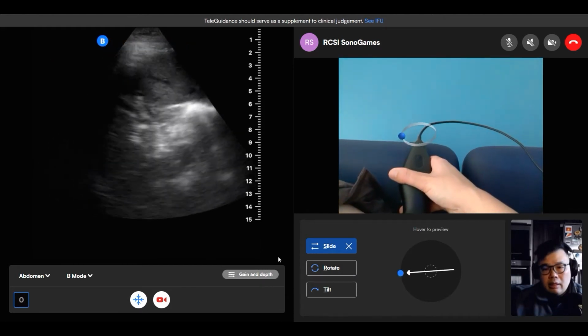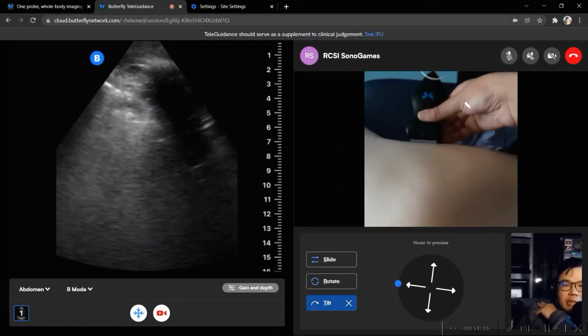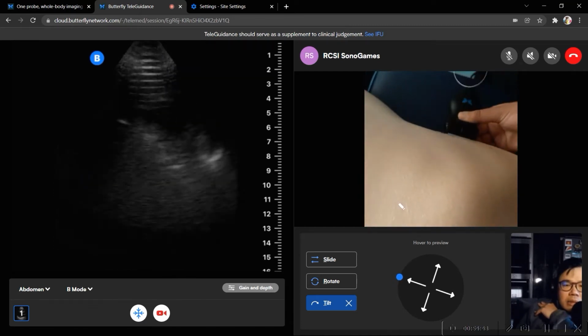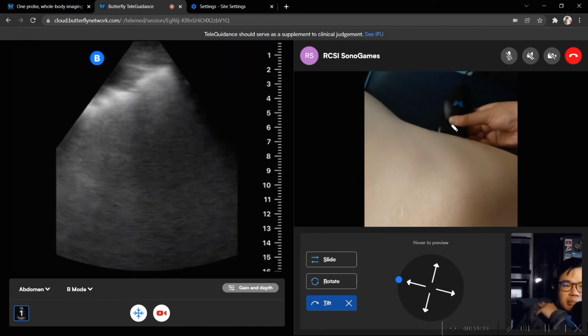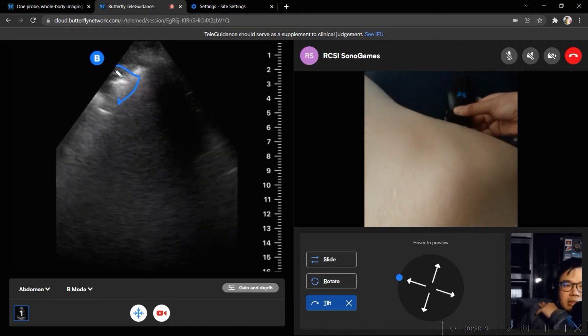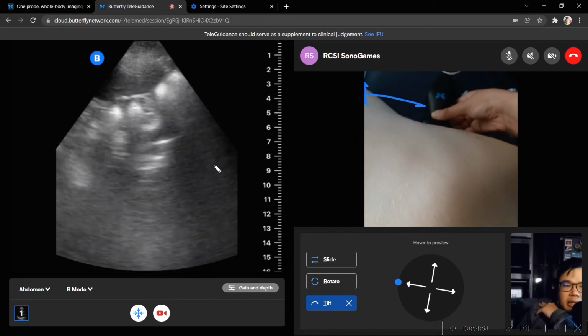Okay. All right, excellent. No, you need to slide the probe. So your hand must almost be touching the bed. Oh, like that? Yeah, but you need to slide the probe back as well. Now that's the tail of the spleen here. Yeah. So you need to go more up, superior. Yeah. There you go.